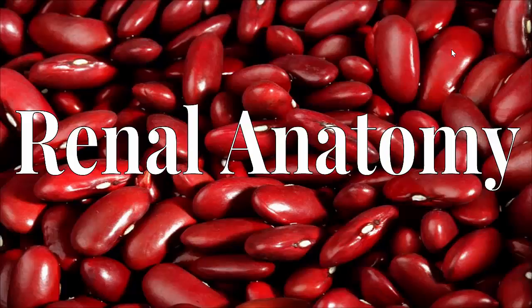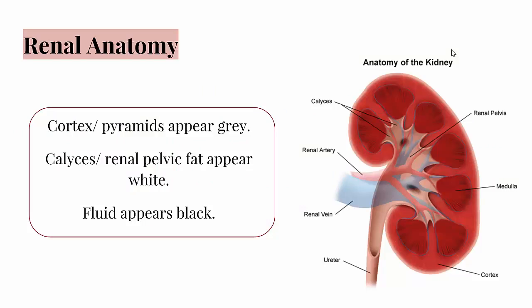All right, so we've talked about where we're going to place our probe and who we're going to be placing it on. Now let's talk about what we should see. Several structures will be evident on ultrasound when assessing the kidney. The cortex and medulla will appear gray, and the medulla may be slightly darker than the cortex. Renal pelvic fat located in the center of the kidney will appear brighter, usually white.